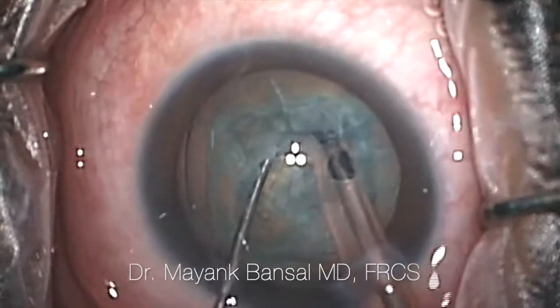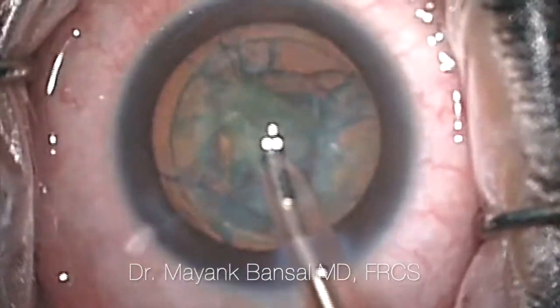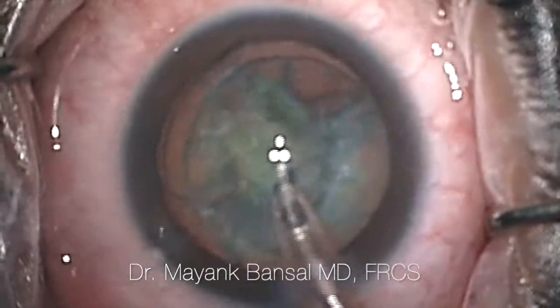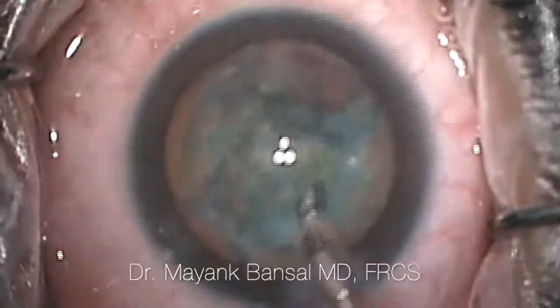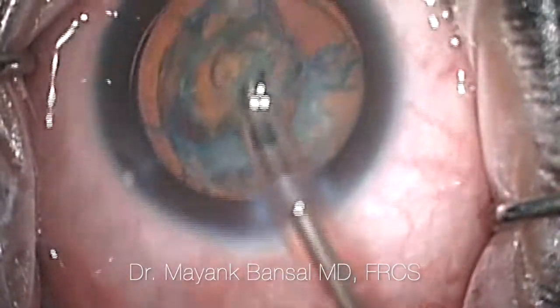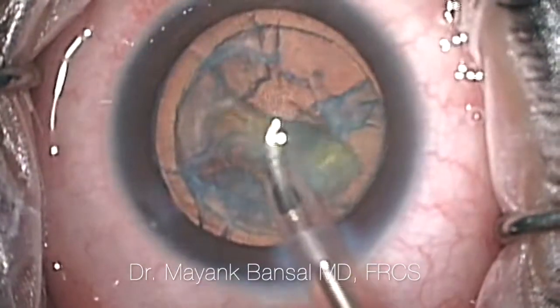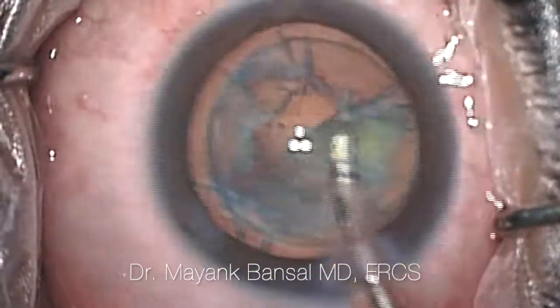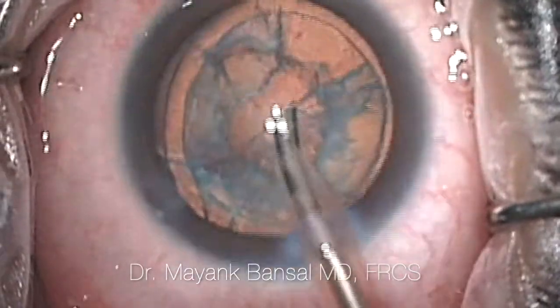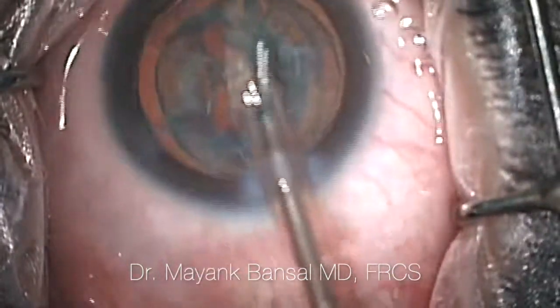We're able to aspirate the nuclear matter more successfully once we have these cracks. Aspirating — or first dissolving, what we call phacoemulsifying — the lens material is the next step. Once all of this phacoemulsification or dissolving of the lens is done, we're able to aspirate it and thereafter take out all of this hard material — all of the cataract.